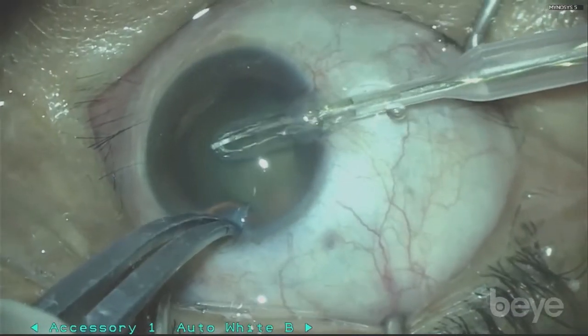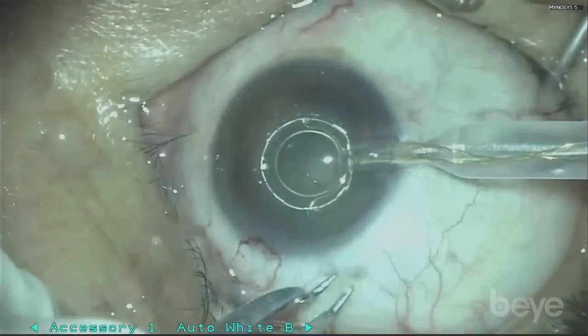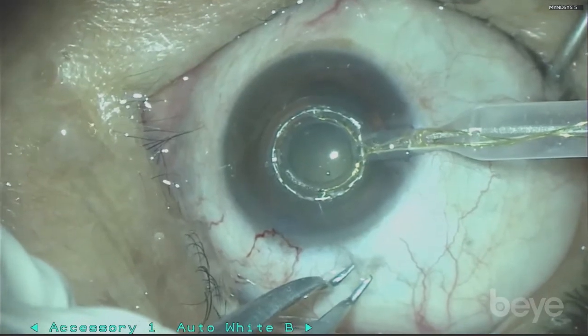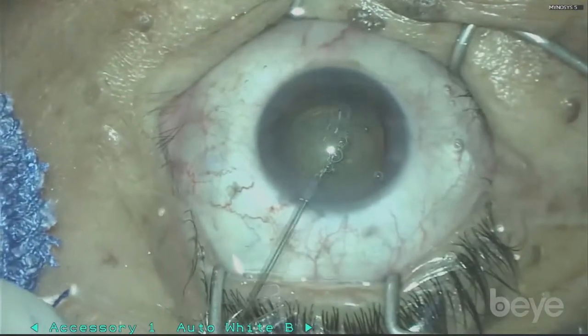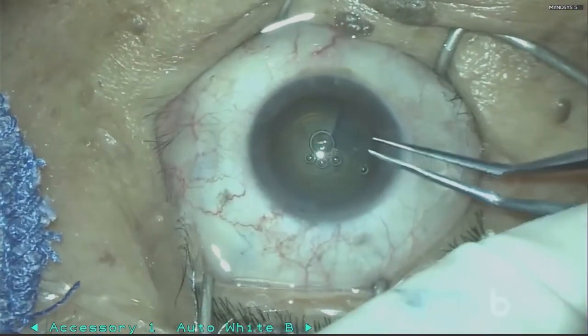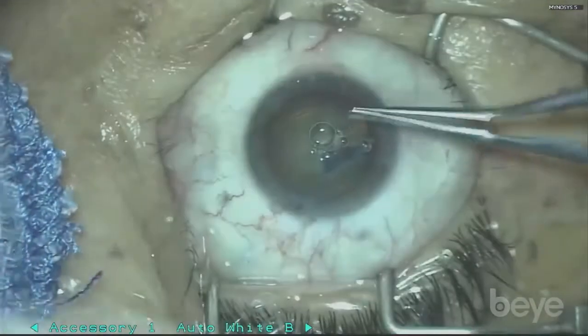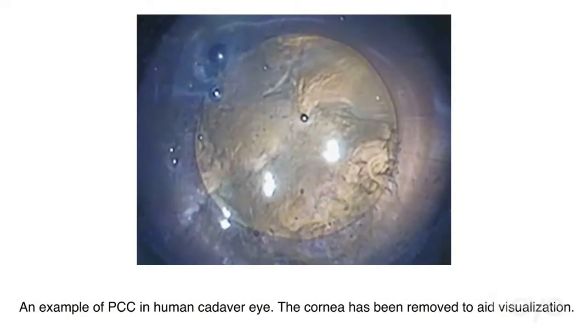What the surgeon would then do is oppose the ring right to the anterior capsule. A little bit of suction is just enough to create a uniform apposition. And then there's a train of brief electrical micropulses that create just enough heat to vaporize water molecules trapped between the anterior capsule and the ring. This is not cautery, but it happens so quickly that there's actually a mechanical cleavage of the anterior capsule. It happens simultaneously around the entire circumference, 360 degrees, all at once — so you're not zipping around as you would with the laser.